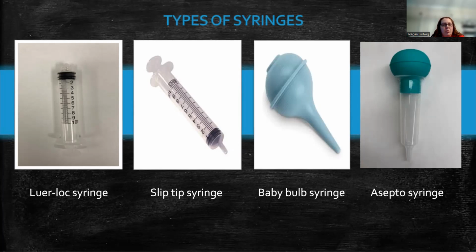It's a lot easier to do that than having to twist it off while it's inside of a vessel. That wouldn't be very pleasant, would it? So this is more of a vascular thing or for other types of, maybe injecting contrast with like a tubing of some sort, not necessarily for injecting local.